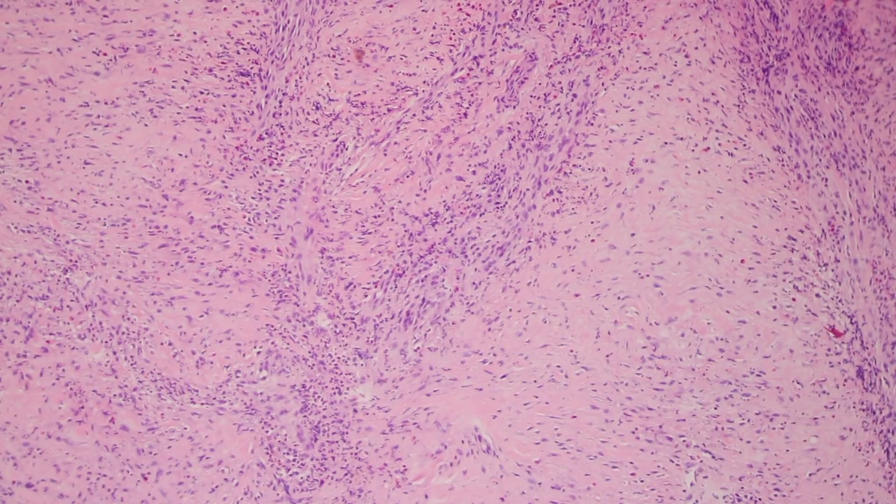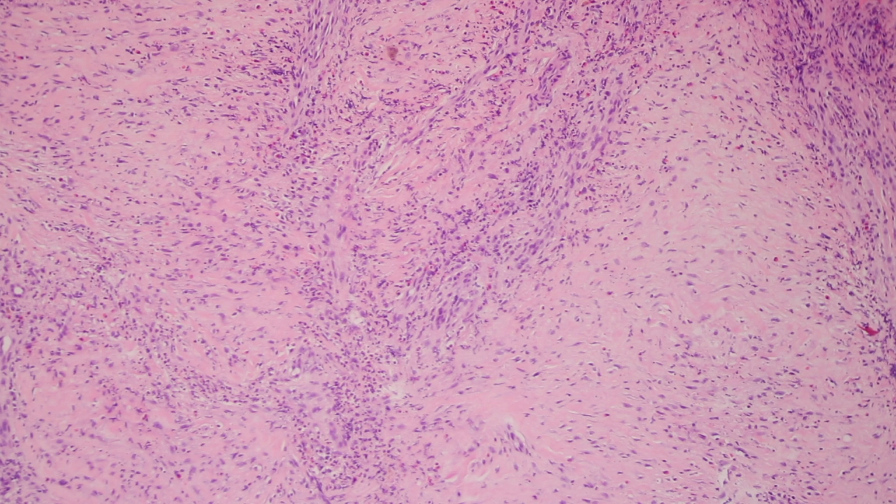And again, Andrew Carlson has written papers about how this pattern of sclerosing vasculitis with neutrophils is seen in other things outside of granuloma faciale and erythema elevatum diutinum. So not everything with that is granuloma faciale or EED, but I think those are both classic dermpath entities, and it's good to know about those. And let me show you another example of EED.